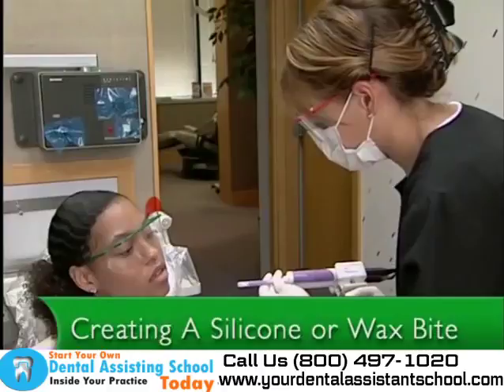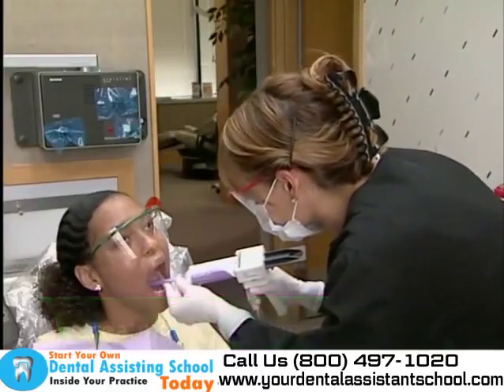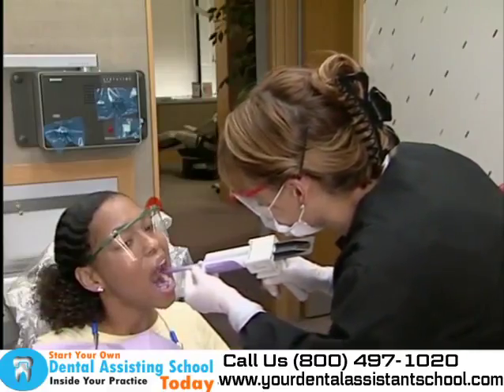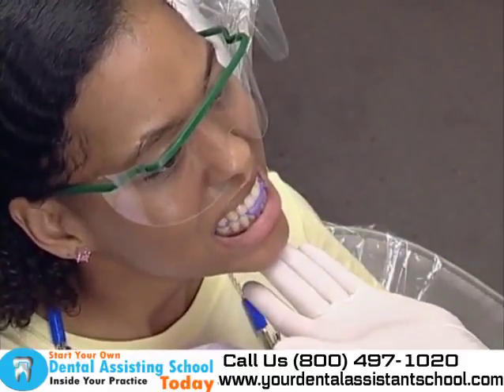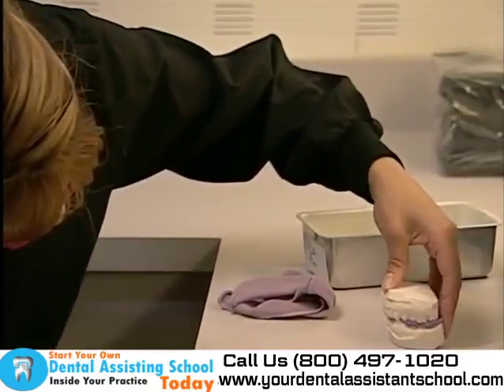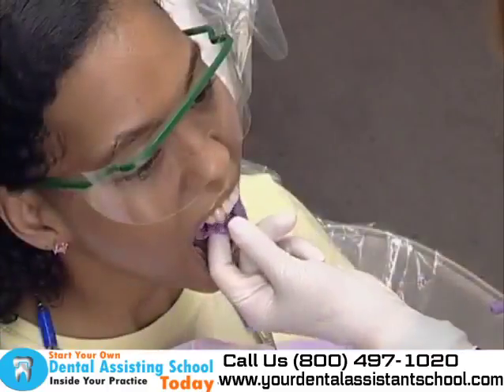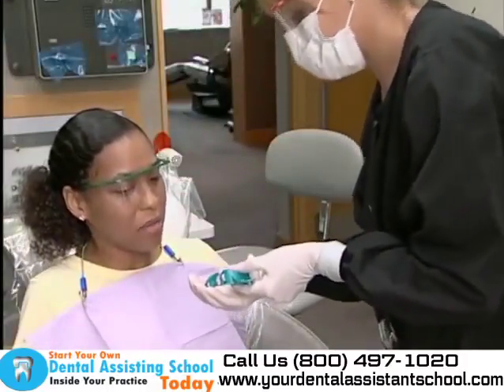A wax or a silicone bite also needs to be created. It is used as a reference to the patient's occlusion or bite pattern. This can be done at the start of the impression procedure, or it can be done after the impressions have been made. The wax or the silicone bite is utilized later in trimming the study model. For both materials, the manufacturer's guidelines and instructions should be consulted.